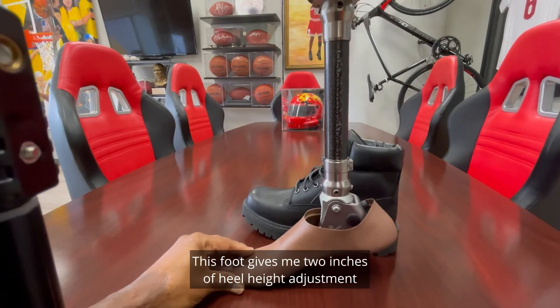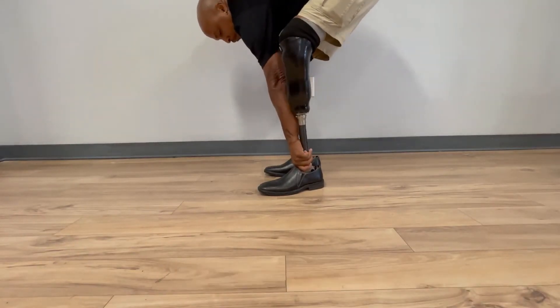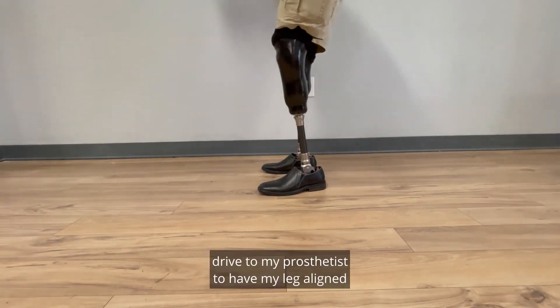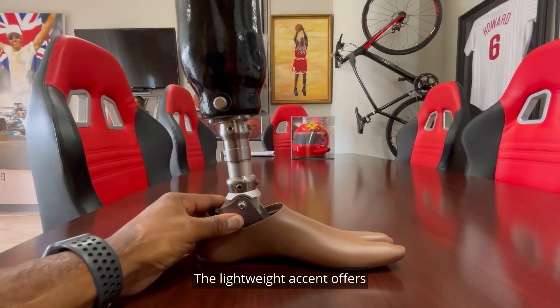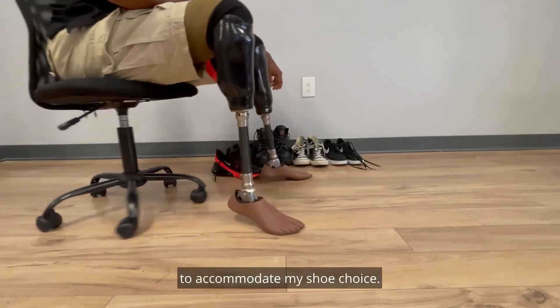This foot gives me two inches of heel height adjustment with a simple push of a button. Instead of having to get in my car and drive to my prosthetist to have my leg aligned to meet a specific heel height, I can do it all by myself in the comfort of my own home. The lightweight Accent offers 13 increments of adjustment to accommodate my shoe choice.